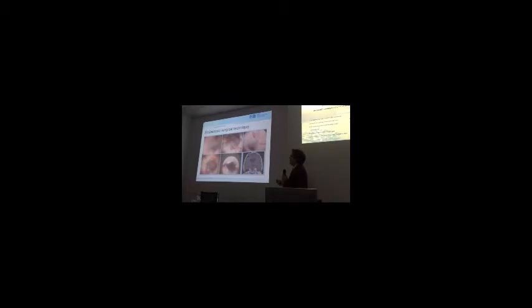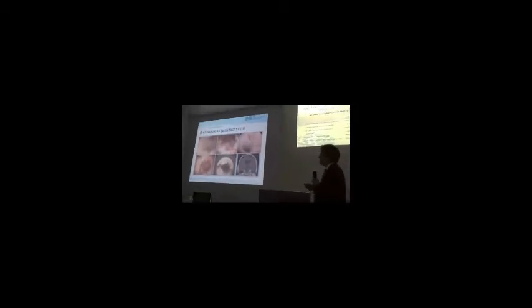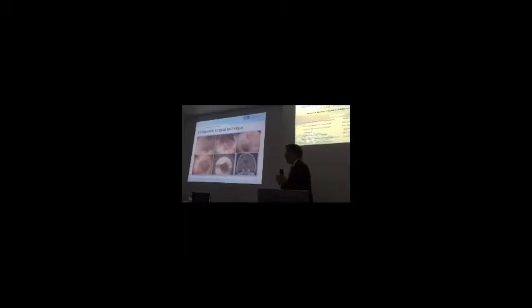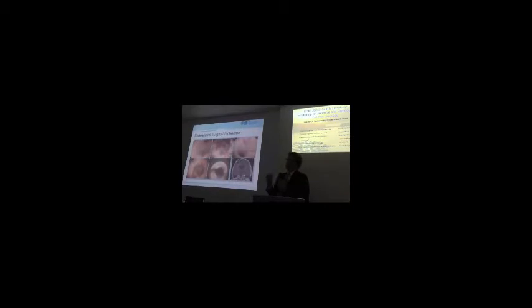You can do, at the end, a thorough inspection of the third ventricle. I always do this, and when you see the data now, we do a lot of additional ETVs in these cases, because when you look at the aqueduct, I see some random blood clots here, which is frequent because you have venous bleeding in almost all of them. I prefer to do an ETV. I don't leave an EVD in most of the cases.